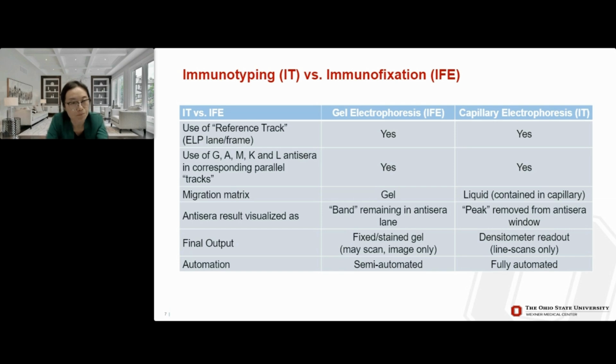manual processing. Please note, a monoclonal paraprotein will be easily detected using SPEP in more than 80% of patients. But in about 20% of cases, only free light chains can be detected in either serum or urine, or only in urine. In today's presentation, due to the time limitation, I will only discuss serum protein electrophoresis.